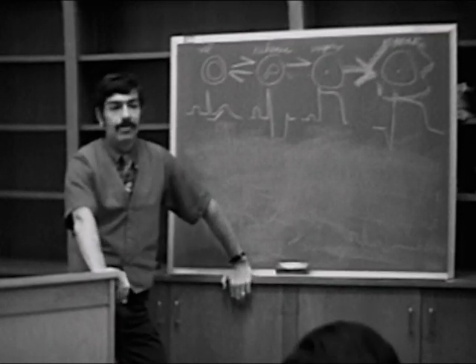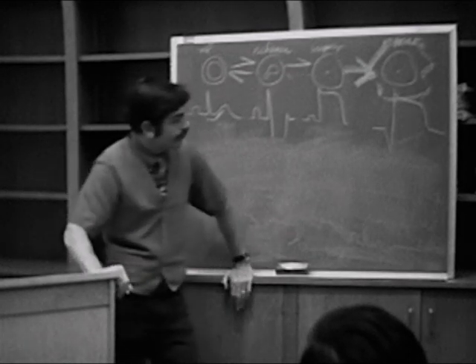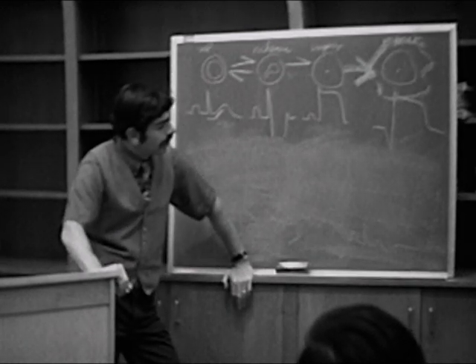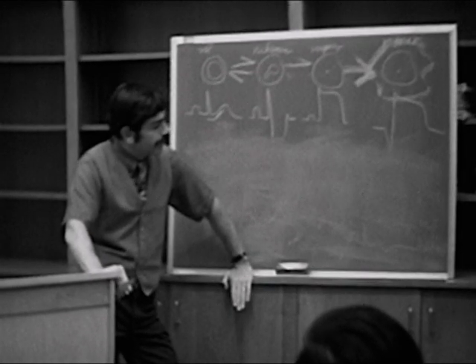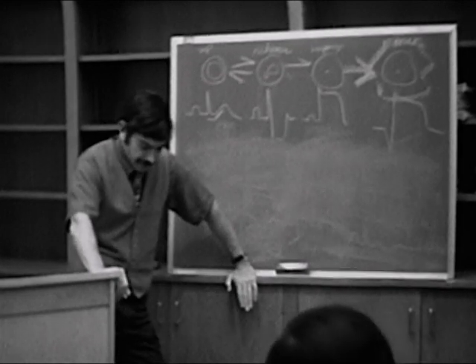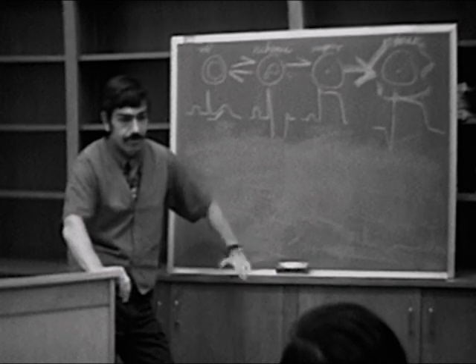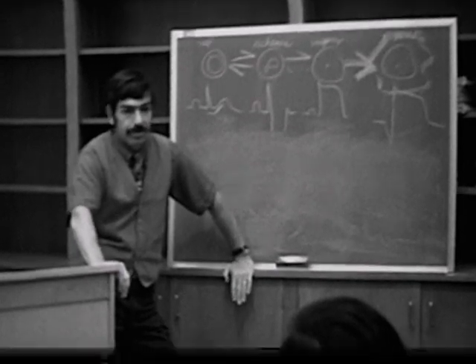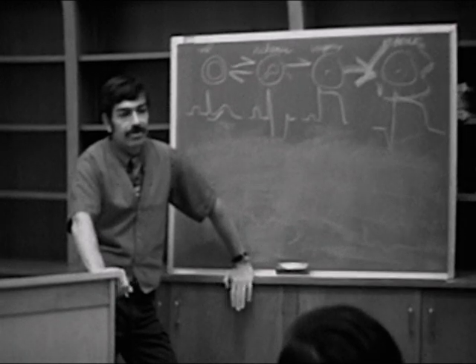Okay. If not, then we'll go on to talk about transmural infarctions. Now, if you're approaching an electrocardiogram, and it's going to be part of our routine to analyze electrocardiograms in a specific manner, going through with a certain routine. One of the steps in our routine will be to ask ourselves, does this patient have an infarct?